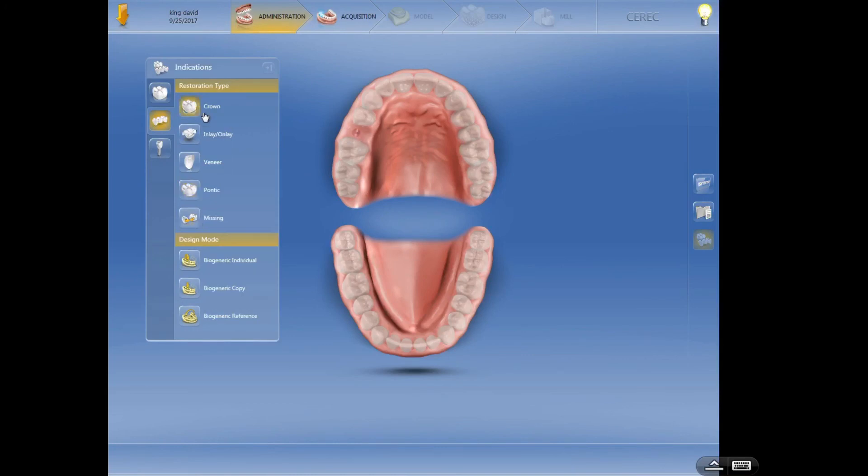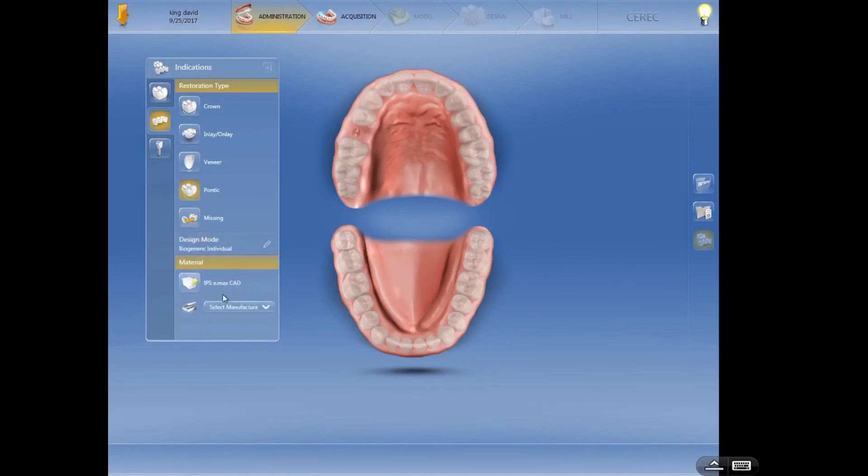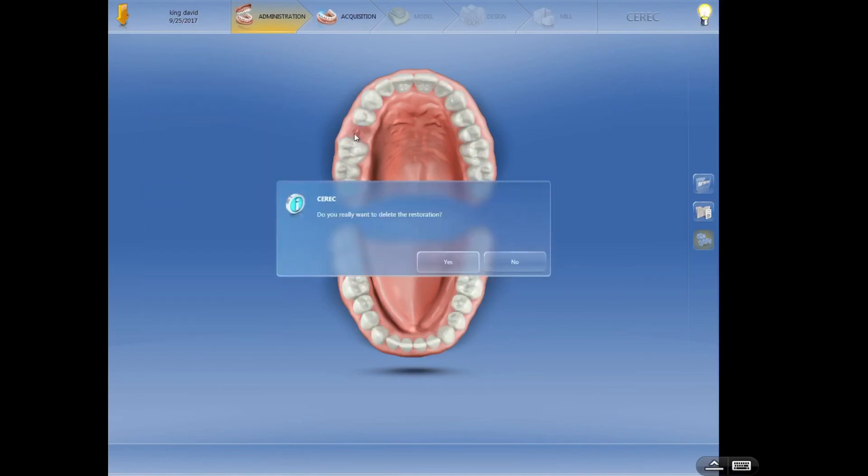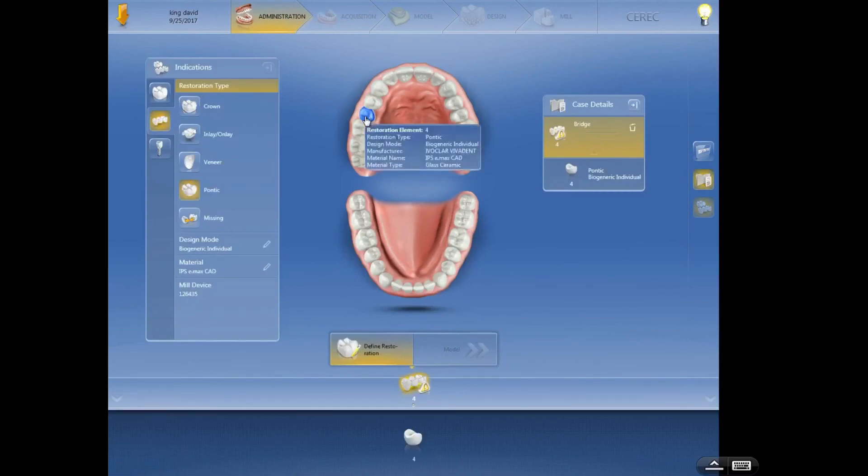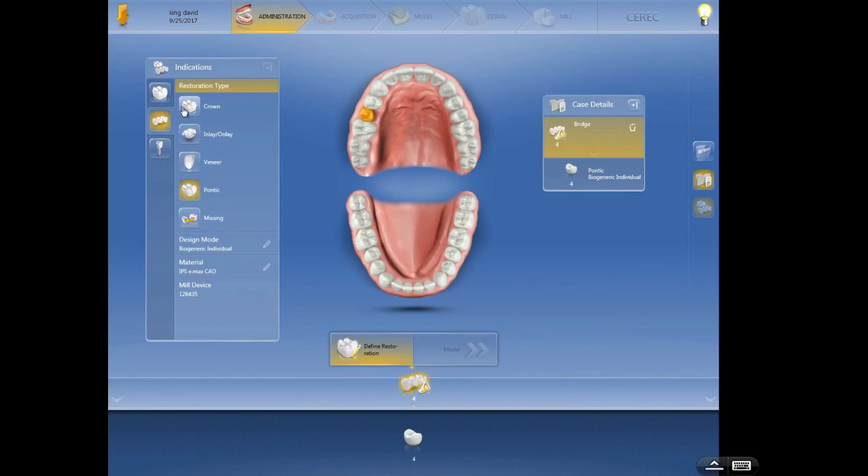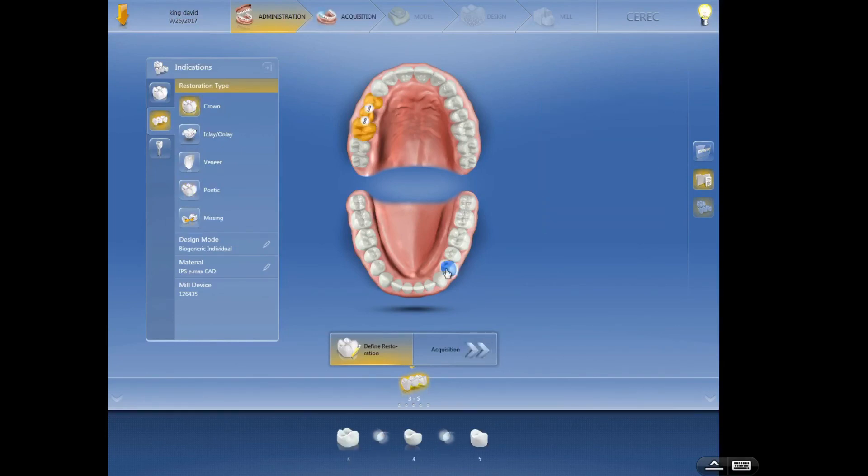Looks like we found one of the glitches in this software version. All right, let's see if I can get past this real fast. There we go. Now it gave me the proposal after I told it the pontic and the biogeneric individual and what I was using to make it and then the crowns right here and right here. Okay, so that's a real basic introduction to crown setup and bridge setup in the software. Hopefully didn't get too confusing.